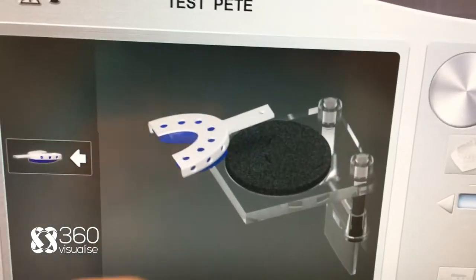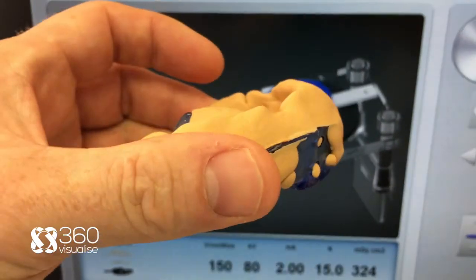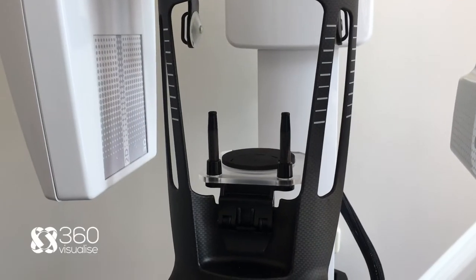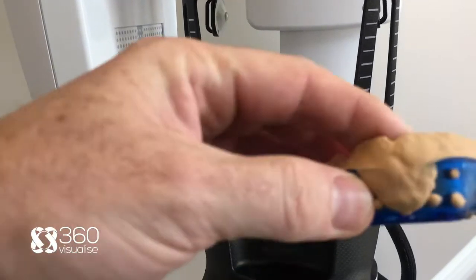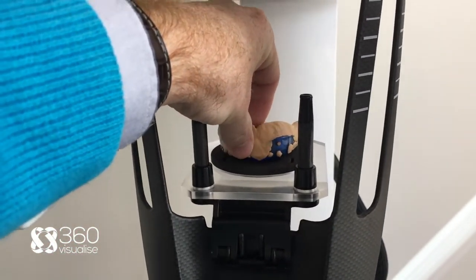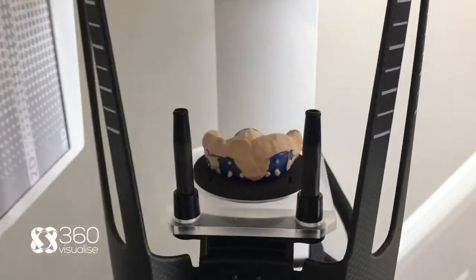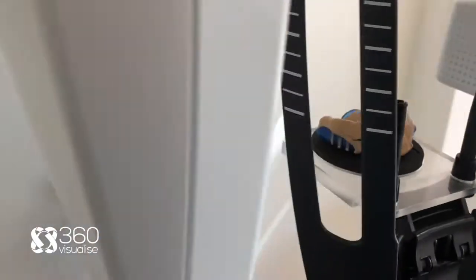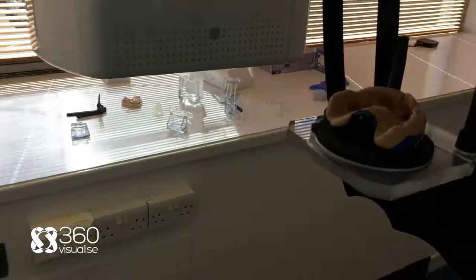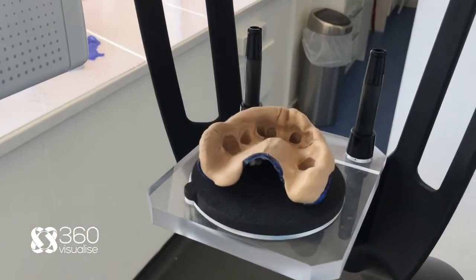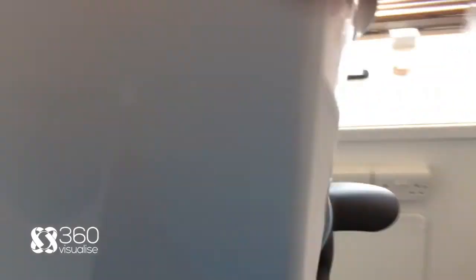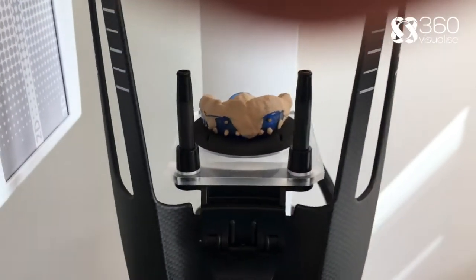Let me take the impression over to the machine and stick it in. Okay, so here we are at the machine. I've got my model, my impression. Put that in the machine like so. Nice and straightforward. The tray is supplied with the machine.